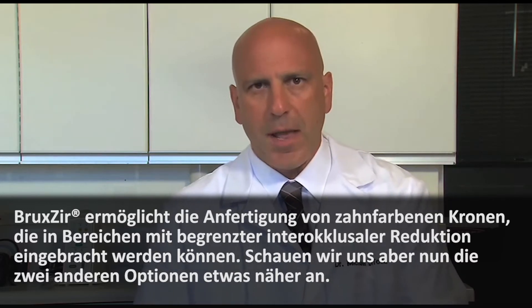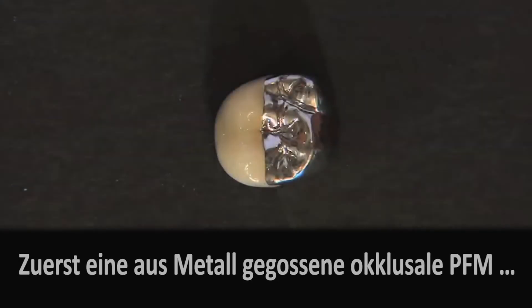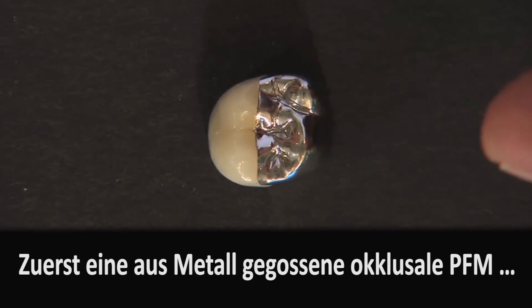With a Bruxer homogeneous 100% zirconia-based restoration, we now have the ability to use something in those areas of limited interocclusal reduction that is still tooth-colored. Let's take a closer look at those three options and talk about what the patient might prefer. One option for a crown prep with limited inter-occlusal space is to use a metal occlusal PFM, as you see here. It's an okay solution — there's really nothing wrong with it from a functional standpoint.